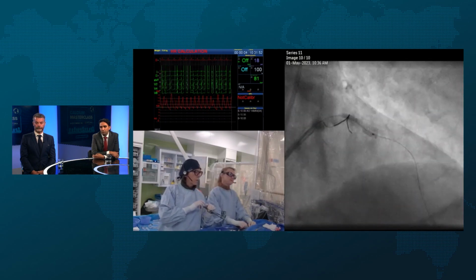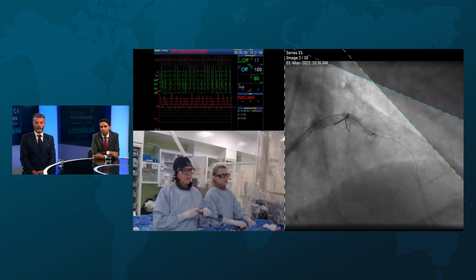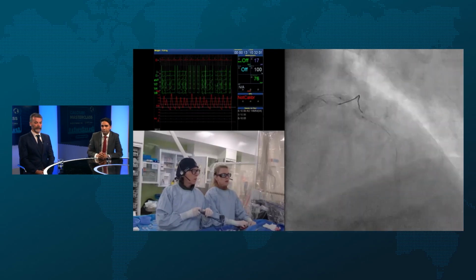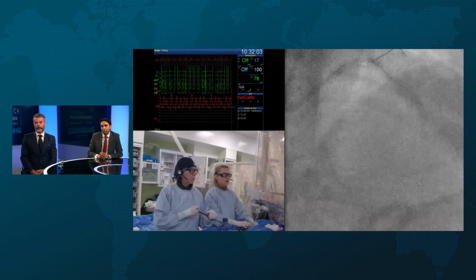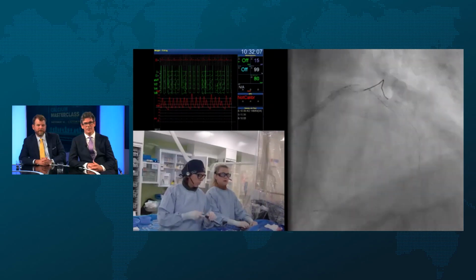There you go. Okay. Look at that, that's 18 on the balloon. Yeah, that's not going. Well, it's also good interventional practice, isn't it, to have that? Still not popped. Not necessarily where you might have even thought you were going to dog bone, just based on the angiogram compared to some of the other things.